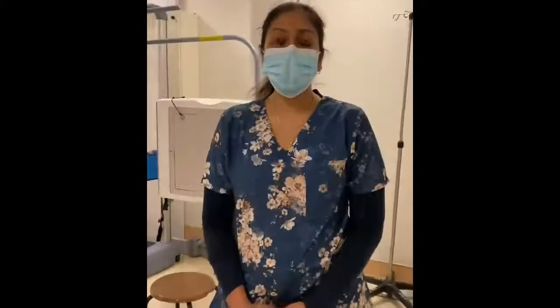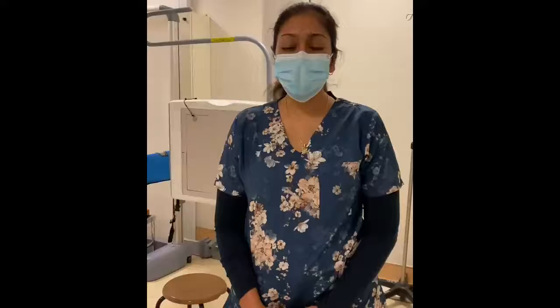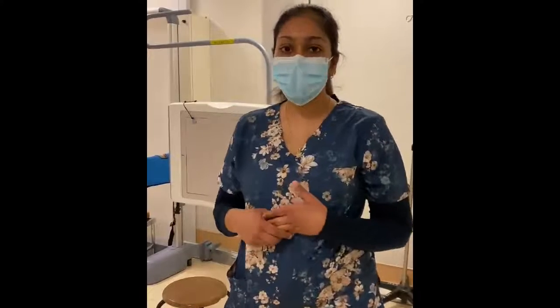Hi everyone, today we're going to do a video presentation to demonstrate your facial bone positioning, nasal bones, zygomatic arches, as well as your orbit positioning. So we're going to start with facial bones. For the facial bones, our routine views that we're going to cover today are your lateral projection, your parieto-acanthial view or your Waters method, as well as your PA axial view.